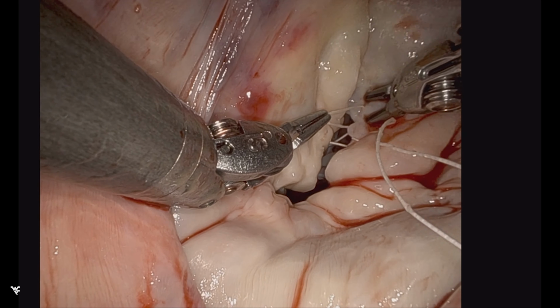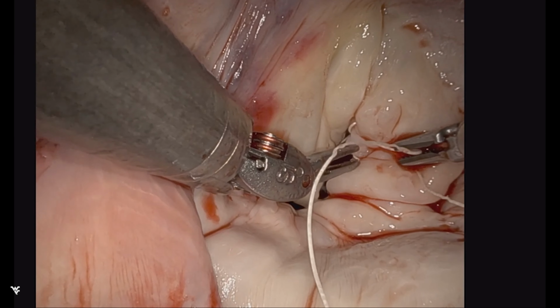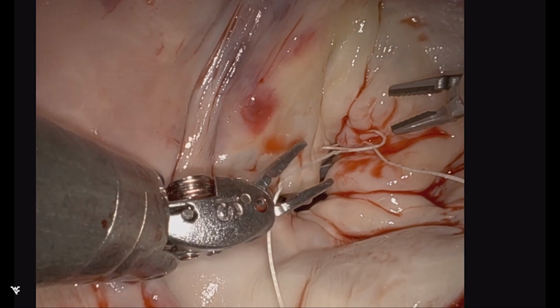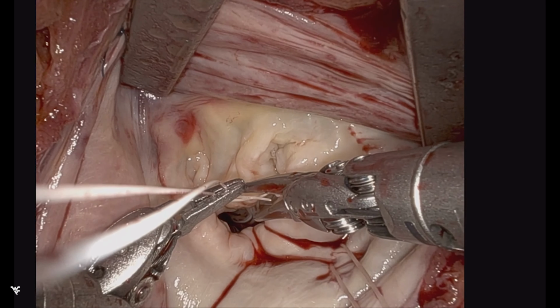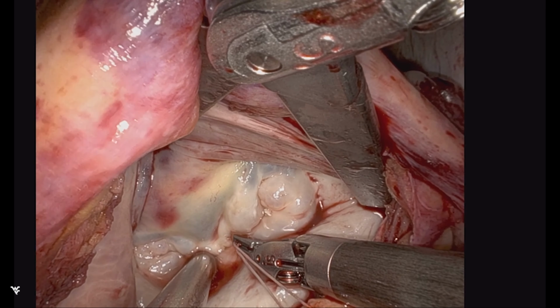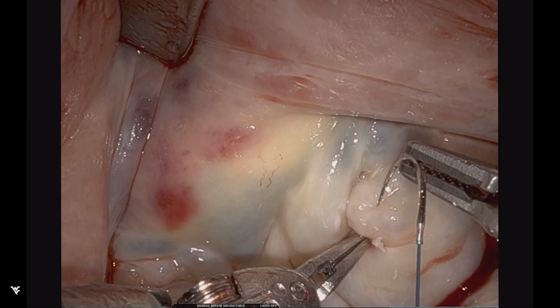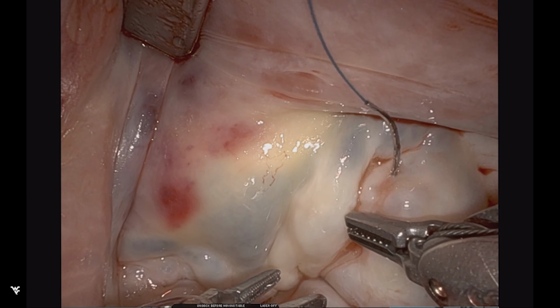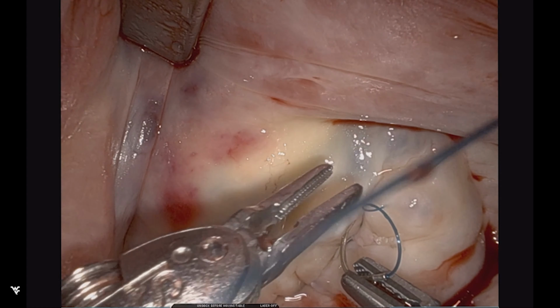Now you can see that needed to be tightened some, so we're now going back and bringing up the loop to enable this to be delivered further, and then locked and tested it once again. And we have that fairly secure with just a minor supportive, in this case, horizontal mattress type of commissuroplasty, just to provide a little extra support to that commissure.